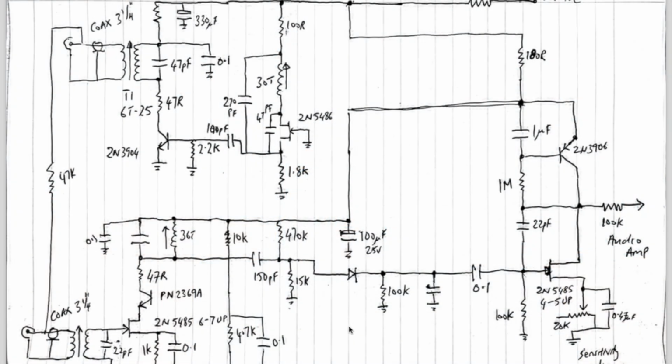If we have a look at the circuit diagram, you can see that this Doppler machine is actually relatively simple. In fact, a lot of the principles in this circuit diagram are taken from technology which we often use in amateur radio, funnily enough. So if we look at the top here, this is the oscillator section of the Doppler, and we've got a source follower type oscillator. I think that's correct. I'm not so clued up on FET oscillators as on valve oscillators, but anyway, we've got a little oscillator here and a 2N3904 which acts as an amplifier, and effectively this is a tuned circuit, and also here's a tuned circuit, and then this connects to your Doppler probe.